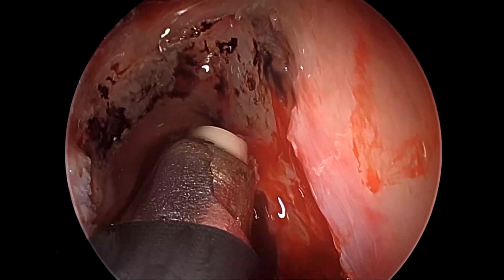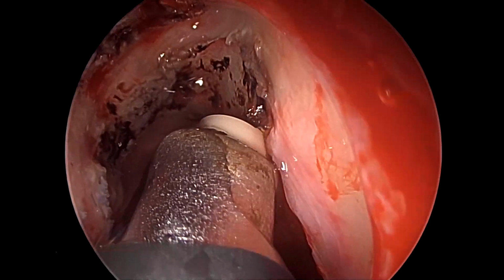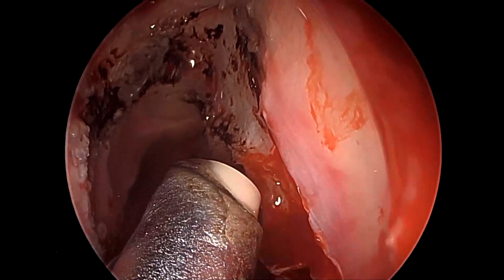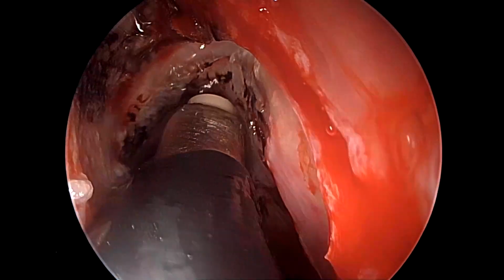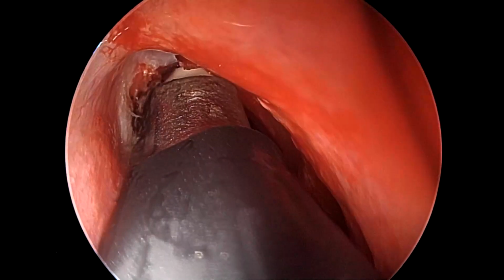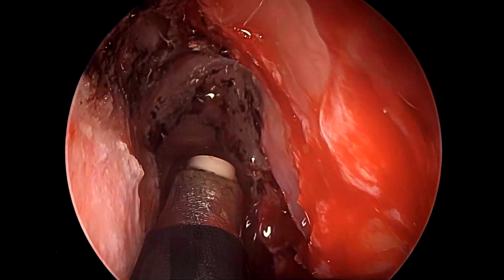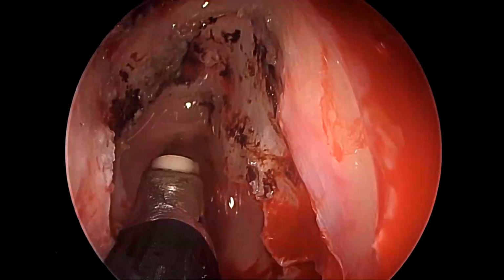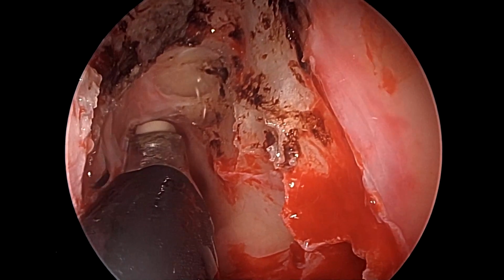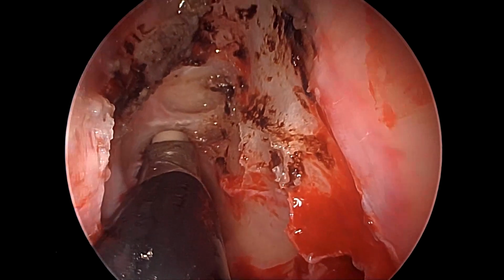We see here that we are just trying to make sure that we're not leaving any mucosal bits there, which could lead to lack of adequate adherence of our future graft material, or lead to formation of mucoceles. So we are taking all the measures here to ablate the entire mucosa around the defect, and much more, probably, for our proper reconstruction.